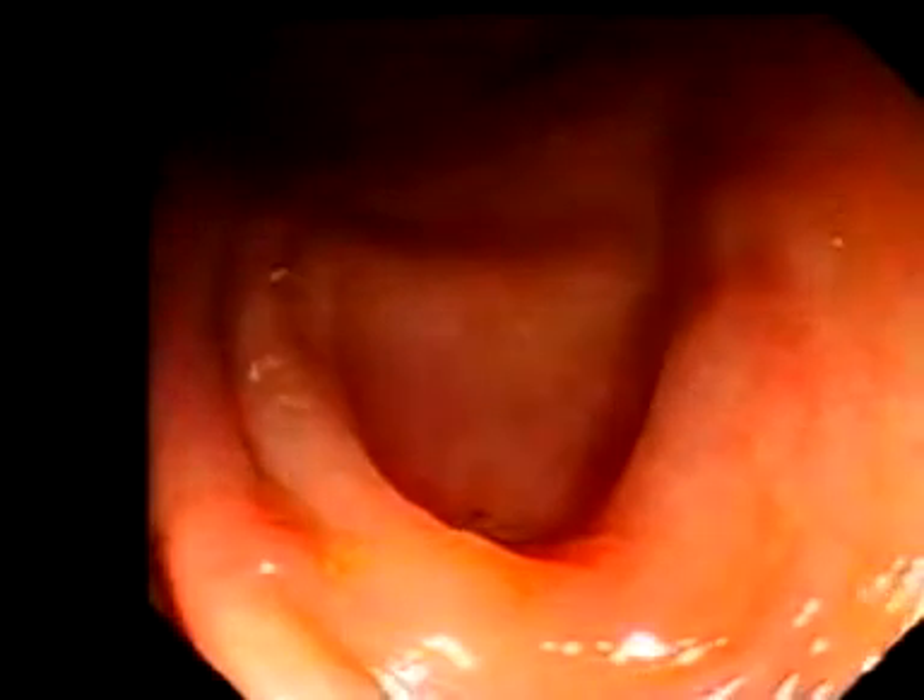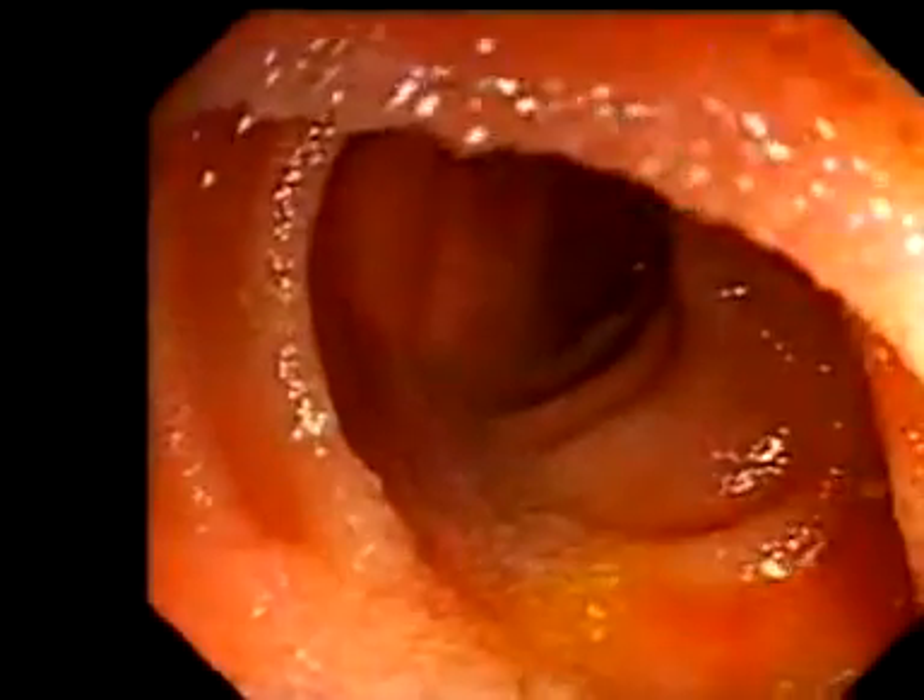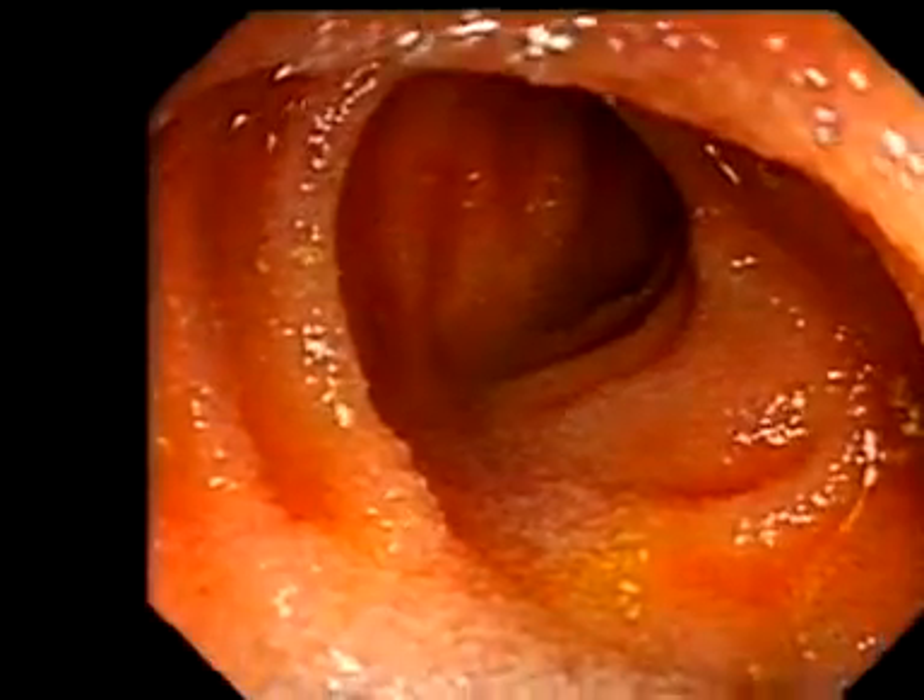Let's find the terminal ileum. Here's the appendix. Angle the scope a little and pull back. There's the ileum. That's the appendix trick — the easiest way to find the ileum.